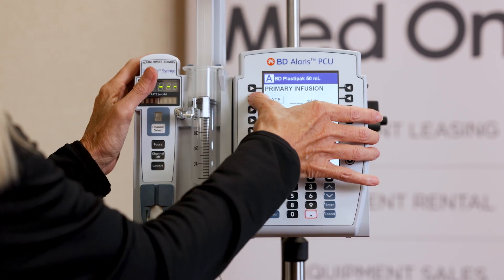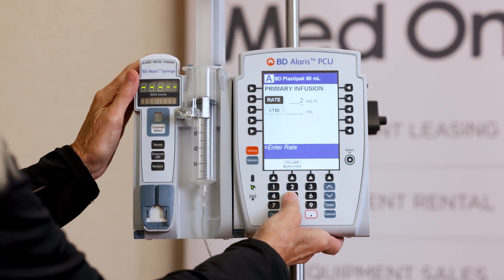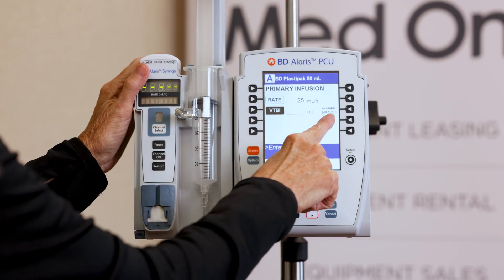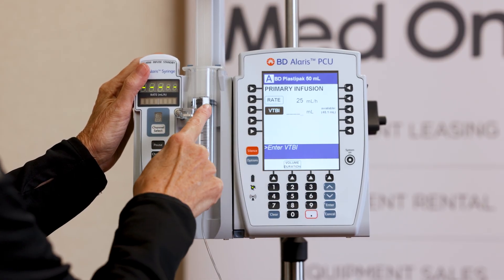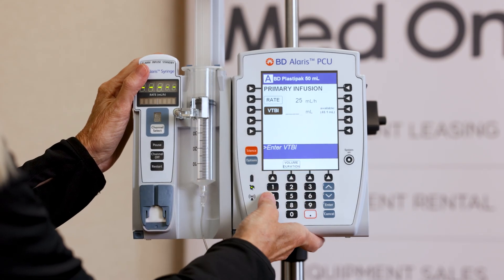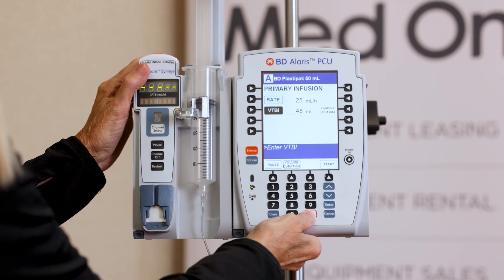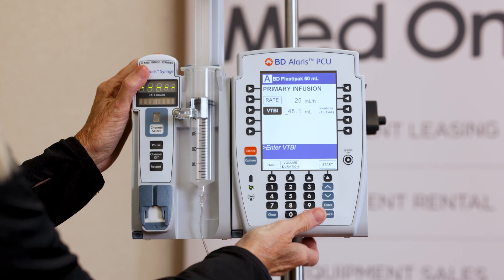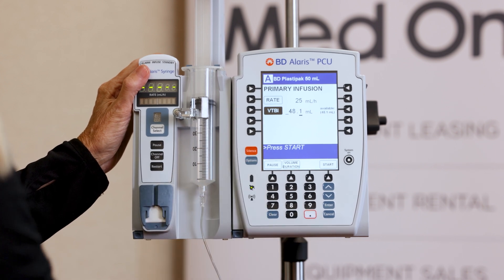I'm going to enter a rate of 25 and the volume — it knows exactly what is available, so if I tried to put in 50 it's not going to let me. This says 48.1, so I want to put in the entire syringe, so I would put in 48.1. Now it's going to tell me to press start, so I go ahead and press my start button.